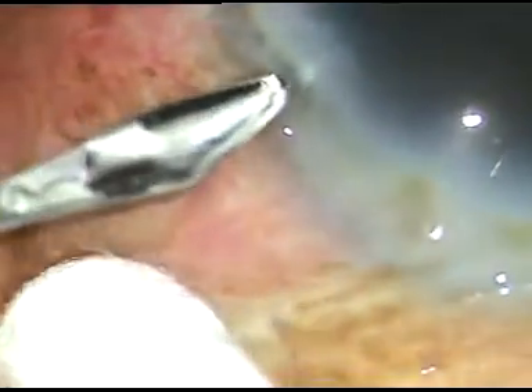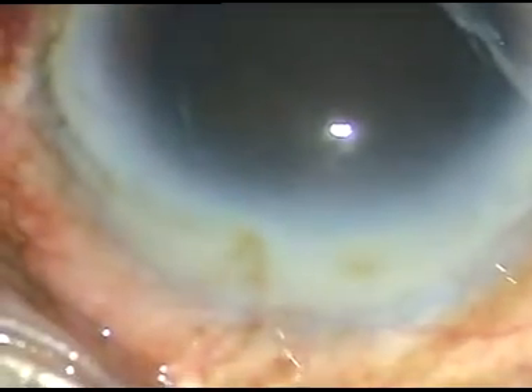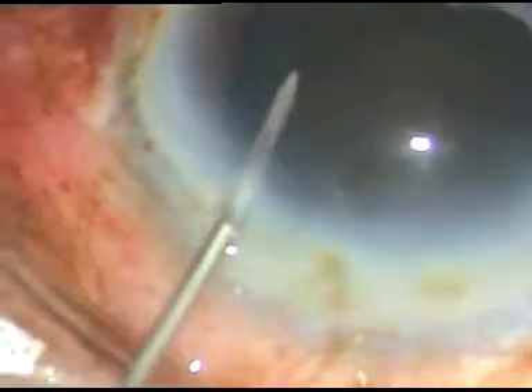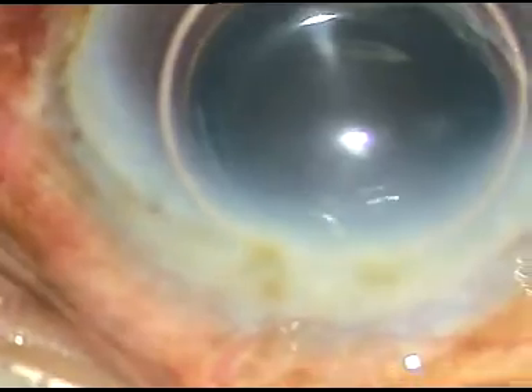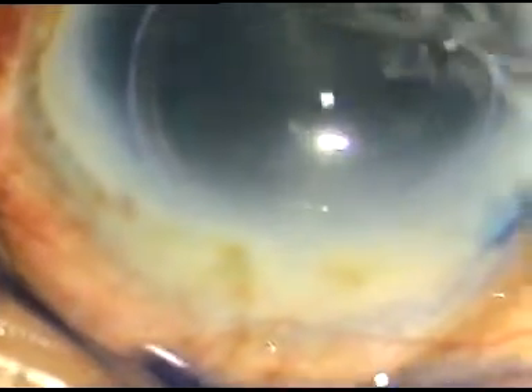This is a side port incision on the left side of the main incision. I want to stain the anterior capsule of the cataract for doing a good capsulorhexis. I want to do a very large capsulorhexis in this hard cataract — about 5.75 to 6 mm in size.